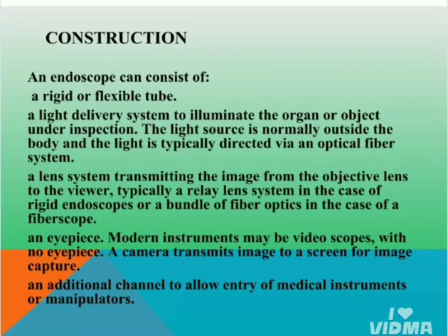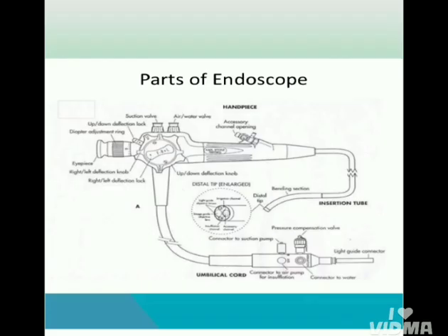An eyepiece; modern instruments may be video scopes with no eyepiece. A camera transmits the image to a screen for image capture, and an additional channel allows entry of medical instruments or manipulators.